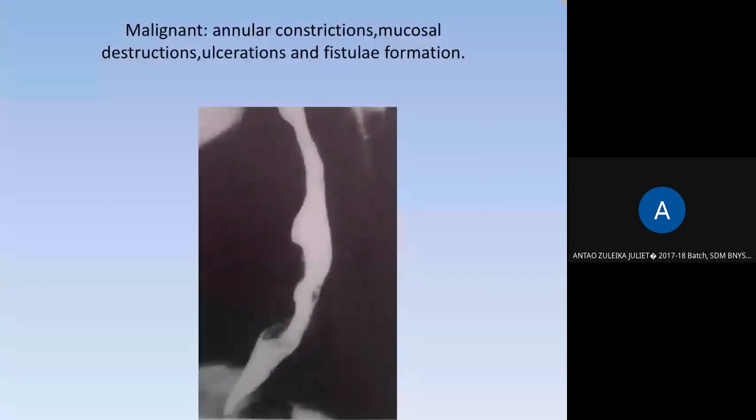Okay, next, the answer is given here. Here also there is an esophagus. What we can see is something that has grown, which is rough. Usually, what we see in surgery is that a growth which is painful is usually benign and not problematic. If you have a painless, rapidly growing something, that is usually malignant, though not 100%, just in most scenarios. And here we can see a malignant growth that has grown into this.